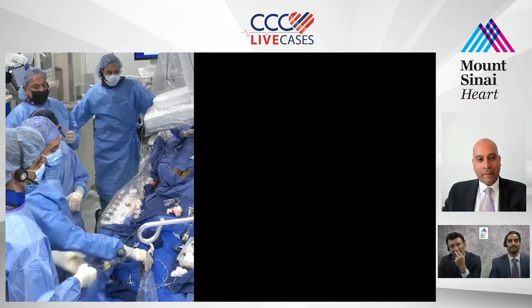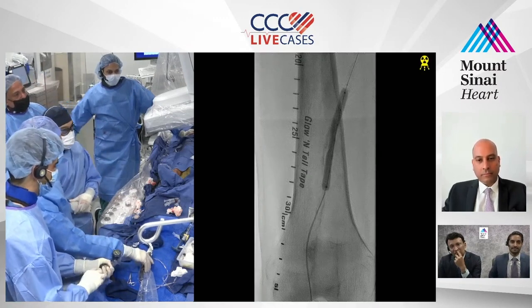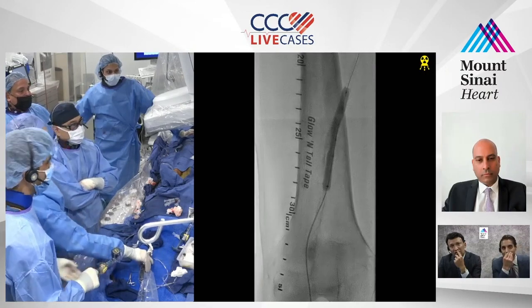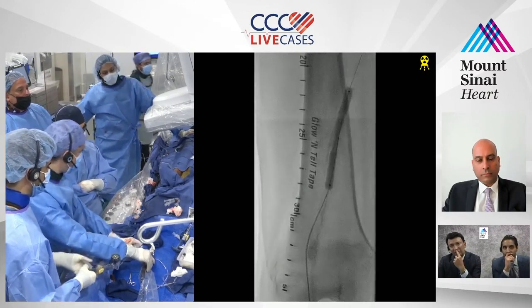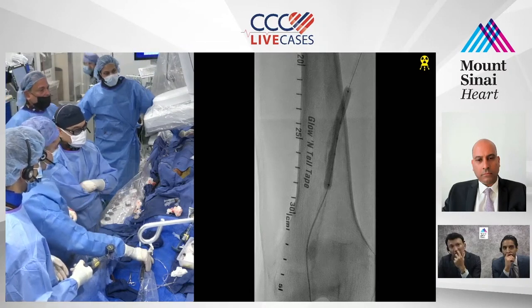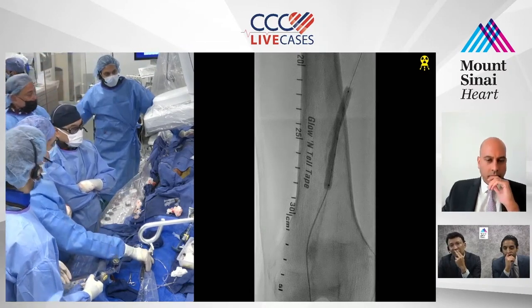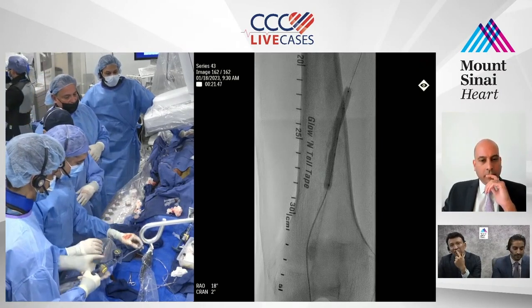So, this is a lady who doesn't have an option. You have to do it again. Let's go to 80. Yeah, we did. So we have to really expand this. The question is, do you think you're intraluminal there, and can we change the wire now? I think we can. No, I would probably go until 15 or something and then change the wire. No, my wire is all trash. So if you've crossed it, I would like to change the wire on this. Yep. Otherwise, we have to pull it this way. Yeah, exactly. Probably go up to 15 or something and then take it out. Well, it's very hard to push, brother. I'm telling you. Yeah, it is. Trust me. And the soft end of the wire, I'm just scared.